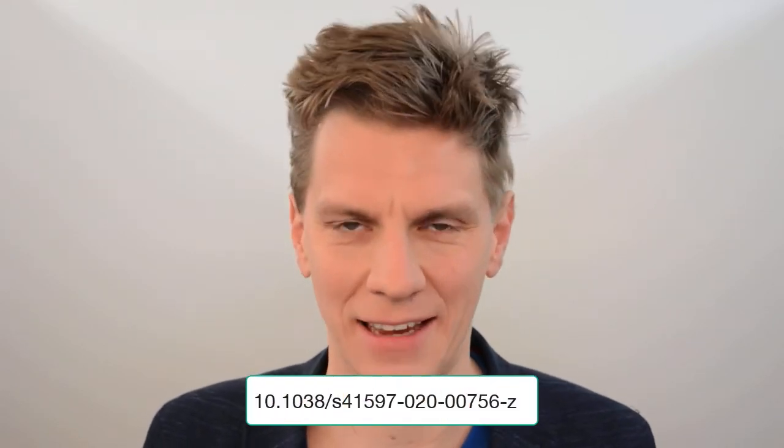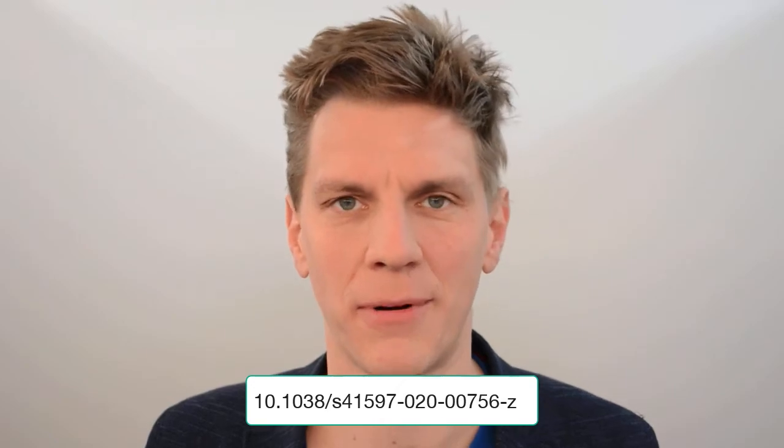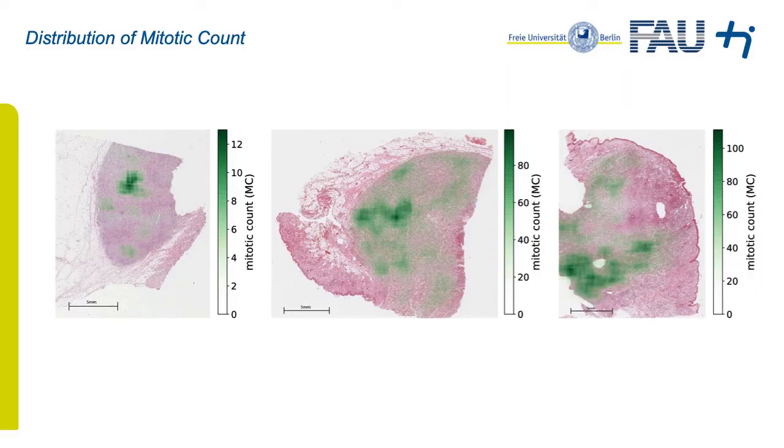You might ask yourself now, so where do these annotations come from in the first place? It's easy. They come from a dataset. So these images are part of a dataset that we published around about a year ago as open data. Thus, we're now able to investigate the mitotic count or the density of mitotic figures on the complete microscopy slide. And if we do that, we see that it's actually kind of patchy. So that means that the region of interest selection is in fact very relevant. Now, I'm sure you have realized that this task is almost impossible for a human to do. Yet it is part of routine diagnosis.